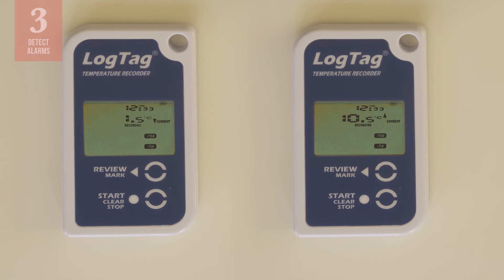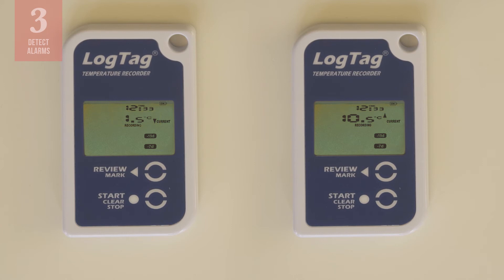Remember that an alarm does not go off automatically when temperatures go out of range. You might see a display like one of these with temperatures above 8 degrees Celsius or below 2 degrees Celsius, but without an alarm. The alarm is not triggered until the temperature is above 8 degrees Celsius for 10 consecutive hours or below negative 0.5 degrees Celsius for 60 minutes. If you saw one of these displays on your log tag, you know that temperatures have not been out of range long enough to trigger the alarm.